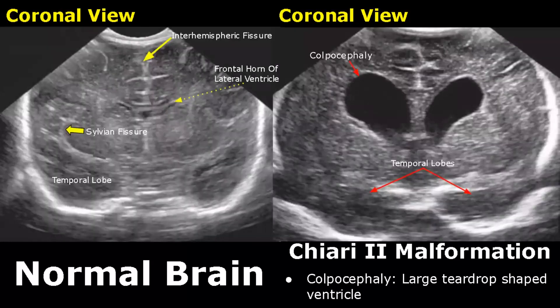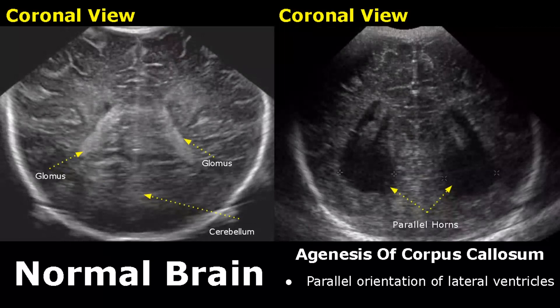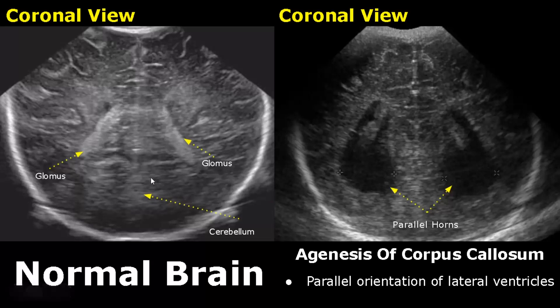Colpocephaly can also occur — this ventricle is large and has a specific teardrop shape. This coronal image shows colpocephaly; it is different from the batwing sign because it has a more rounded shape. This image shows the posterior aspect of the brain — this hyperechoic structure is the glomus of the choroid plexus, which is basically the largest part, and down here is the cerebellum.